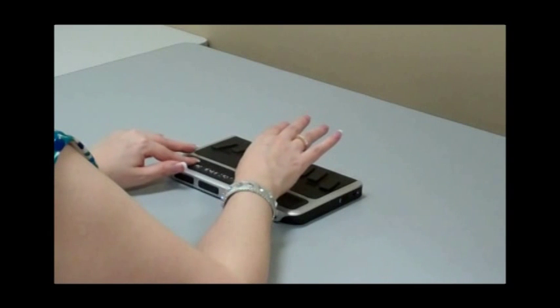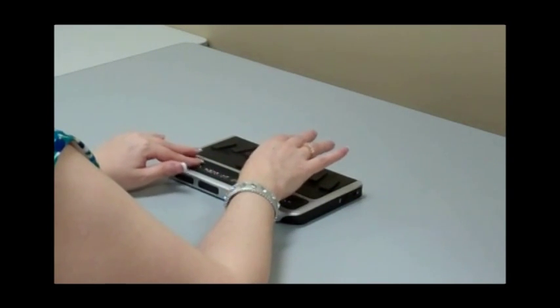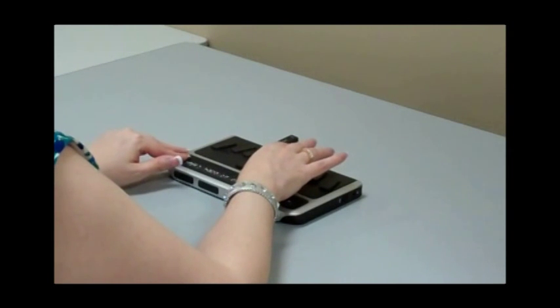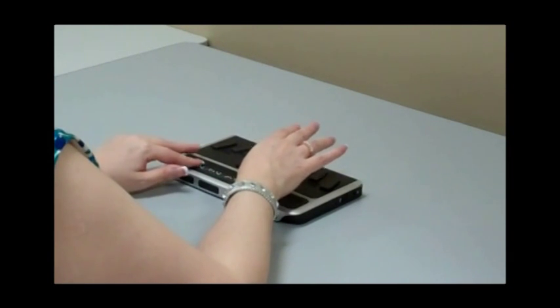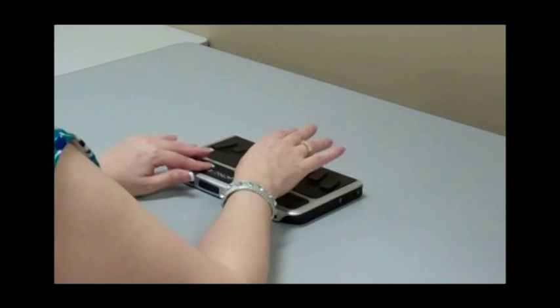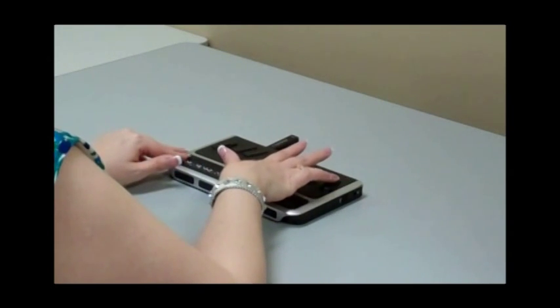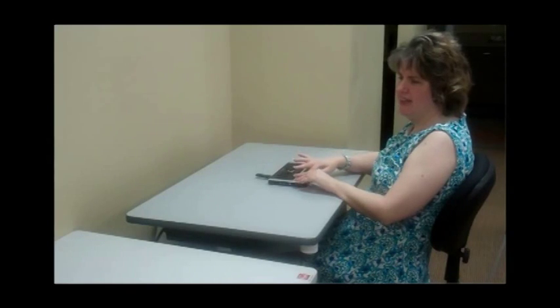All documents in alliswell.doc. All is well. Battle Hymn of the Republic.doc. Battle Hymn of the Republic. Did you feel the mountains tremble.doc? Did you feel the mountains tremble? For every mountain choir.doc. For every mountain.doc. For every mountain. Here's a song that I sing.